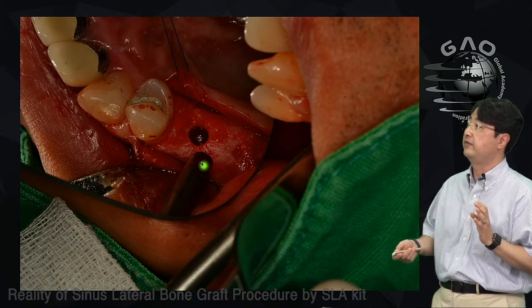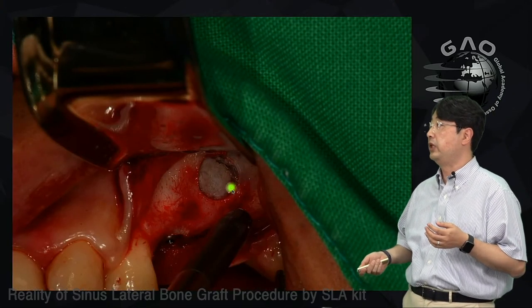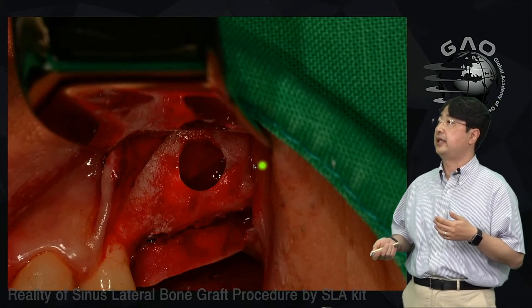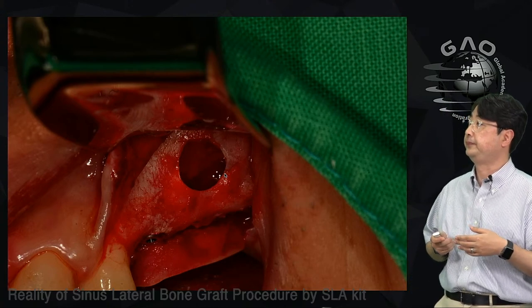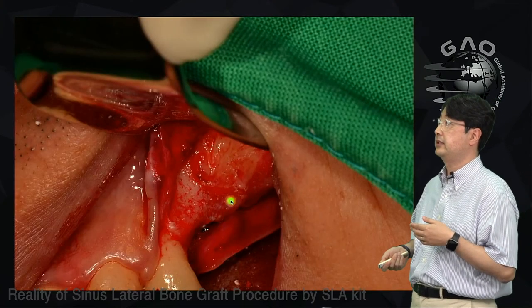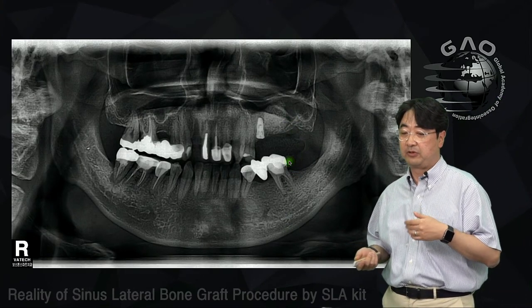So this is a clinical picture like this. This is the number 25 implant site where I did a sinus graft from the crestal approach. And here you can see my window made by the SLA for the posterior implant with the lateral approach. Okay. So here I dissected the membrane in the same fashion that I showed you in the movie clip. And I did a bone graft, right? Like this. And I placed the implant. Then I covered it with sutures. Oh, I haven't placed the implant for number 27. I'm going to place it later.